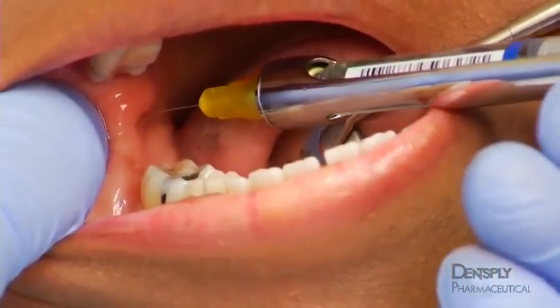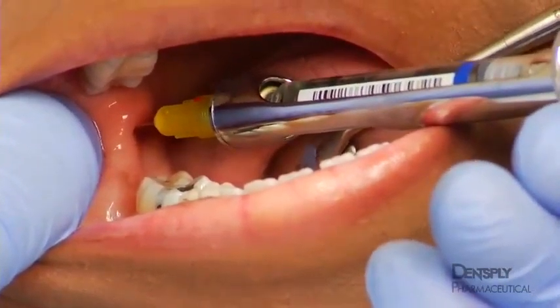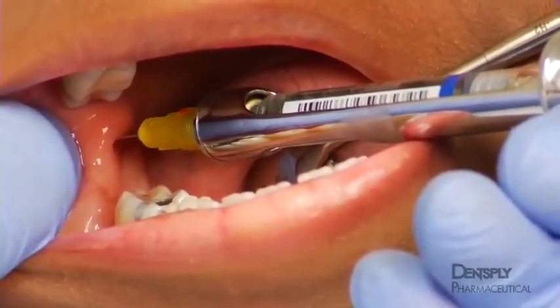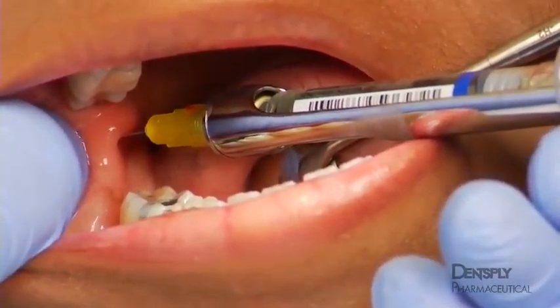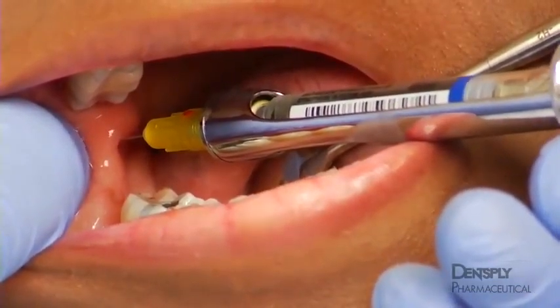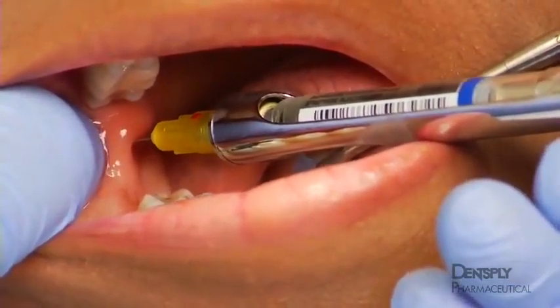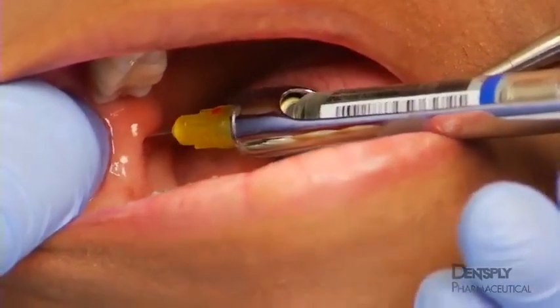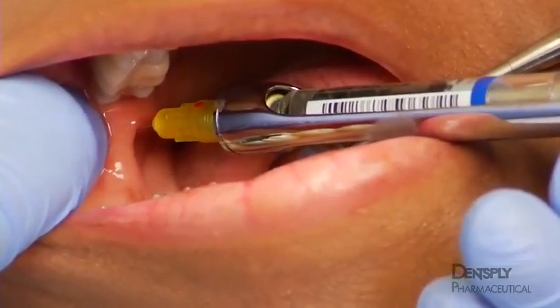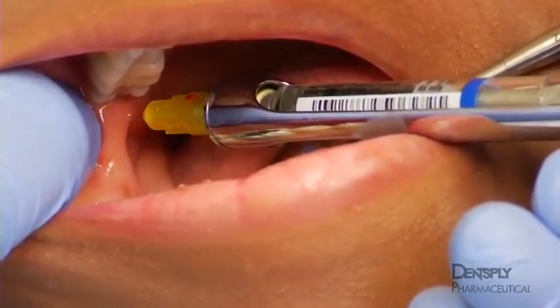The needle is then inserted slowly through the mucosa and buccinator muscle and into the pterygomandibular space. A few drops of anesthetic solution delivered as the needle is advanced may help reduce the discomfort of needle insertion. Once bone is contacted after an insertion of 2 to 2.5 centimeters, the needle is withdrawn slightly and an aspiration test is performed.